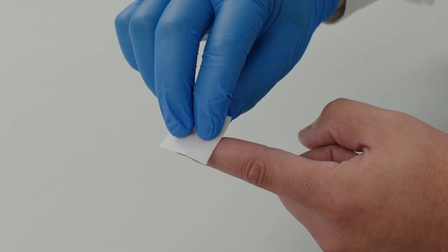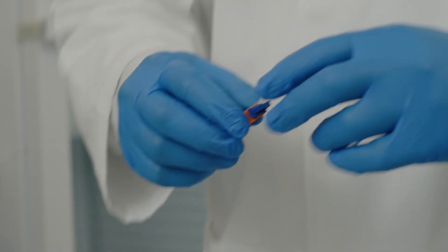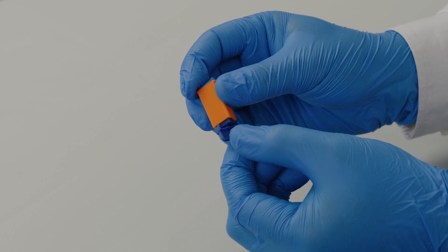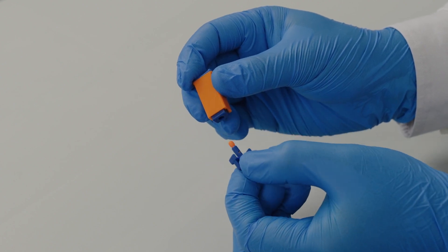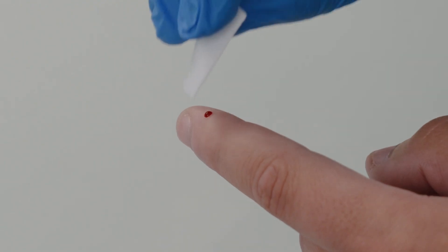Clean the finger with a sterile wipe. Remove the cap from the lancet. Use the lancet provided to prick the finger. Wipe away the first droplet of blood.